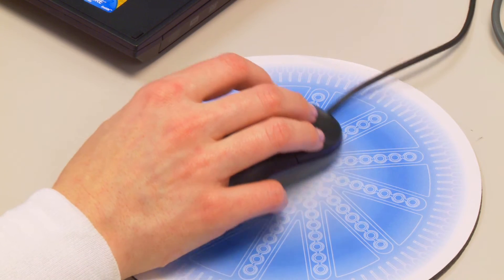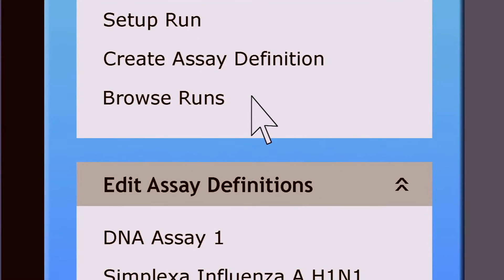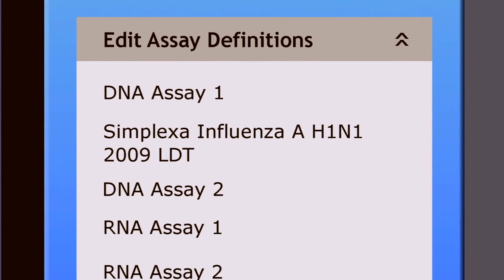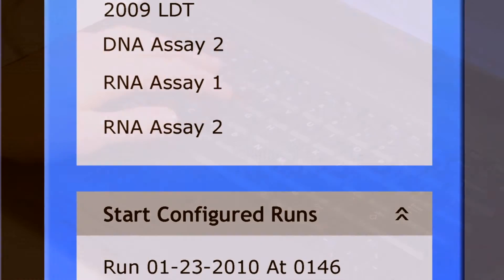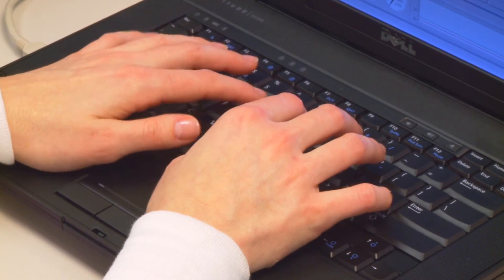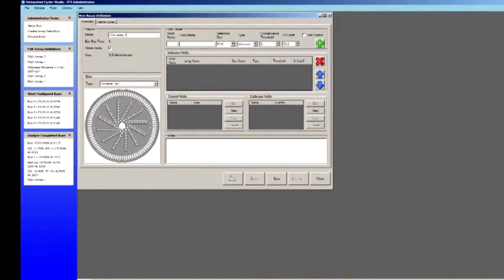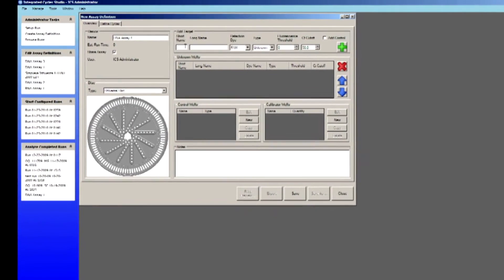LIS compatibility and bidirectional connectivity allows for seamless integration into your lab. The Quick Pick menu items provide quick access to commonly used features with a single mouse click, allowing you to easily create assay definitions, test names and input target, control and calibrator information.